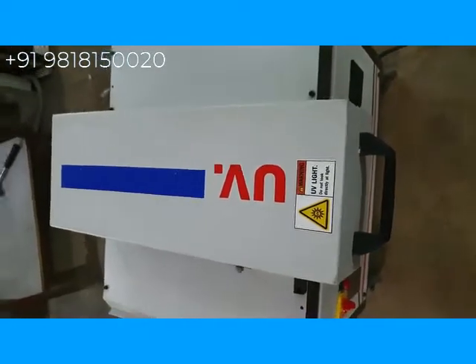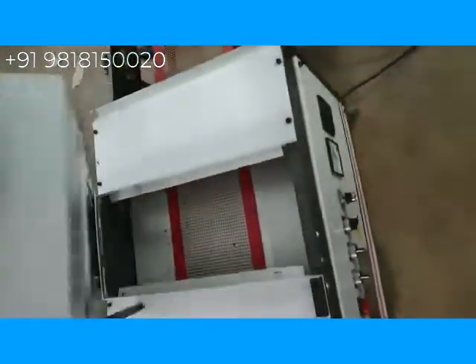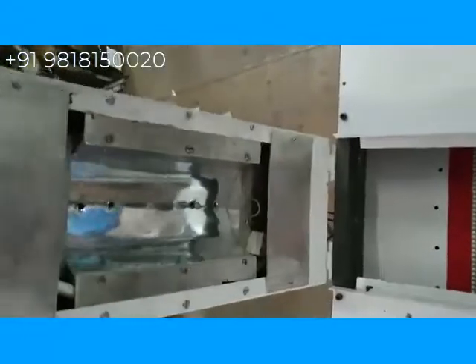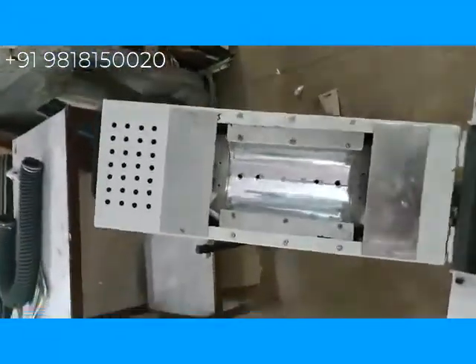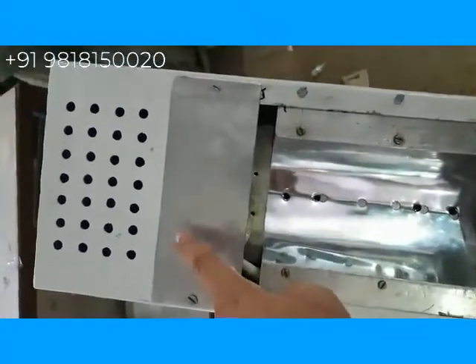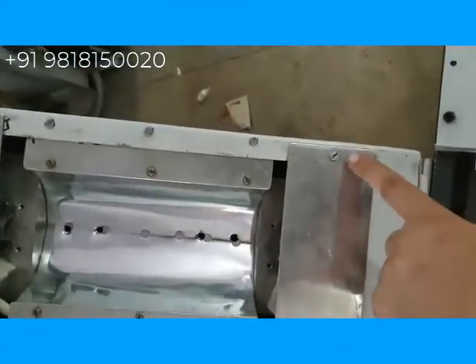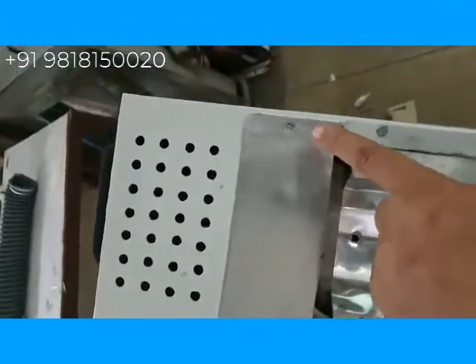First of all, lift this hood up to install the UV lamp. You need to first remove these two plates — one and two. You have to remove these screws and take out these plates.